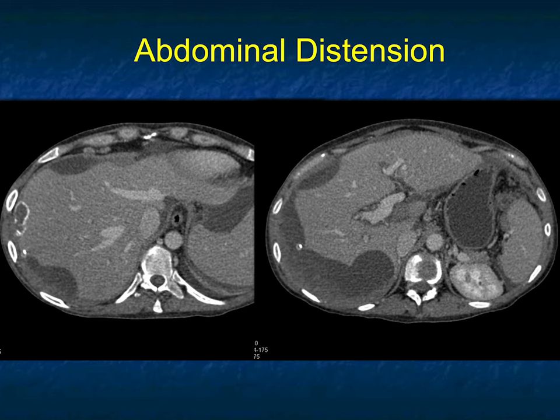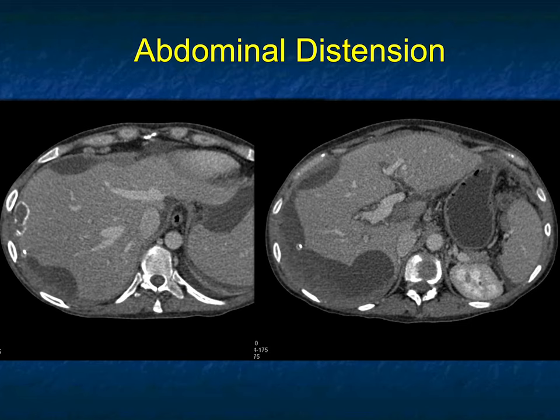This patient presents with abdominal distension. On these two images of the upper abdomen, you notice multiple scalloped lesions including a partially calcified lesion along the surface of the liver, there's ascites, and what looks like carcinomatosis. To me this is carcinomatosis — it could be colon cancer, ovarian cancer, or pseudomyxoma peritonei.